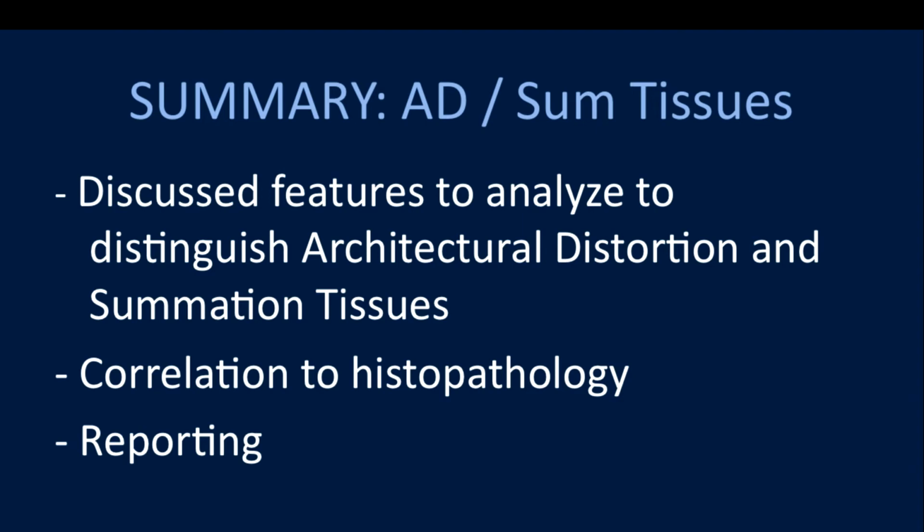In our experience, some of those tiny little distortions that we need to use tomo guidance to biopsy are actually quite challenging sometimes to biopsy. They're lucent, they're hard to see, you have 1 or 2 slices to target, and some cancers have a lot of fibrosis associated with them. So anecdotally, and also I think pathologically, you may clip part of it and get fibrosis and miss the cancer cells. So I would be cautious about accepting that unless you feel like you've really sampled it, your clip's dead on, and you've taken extra cores. We typically will excise it.